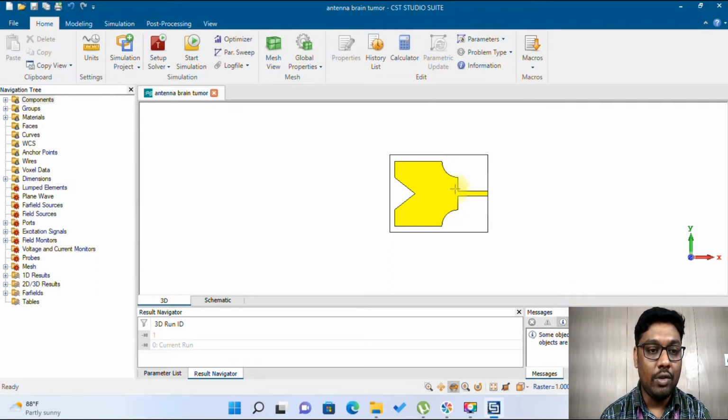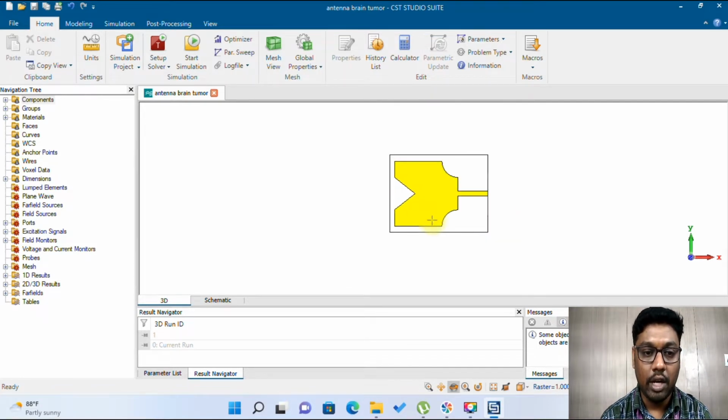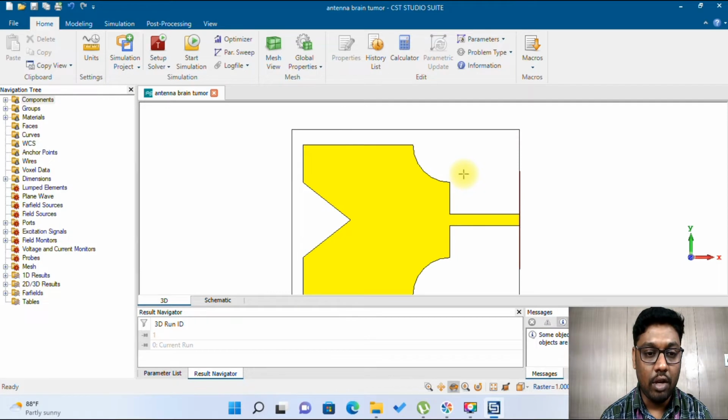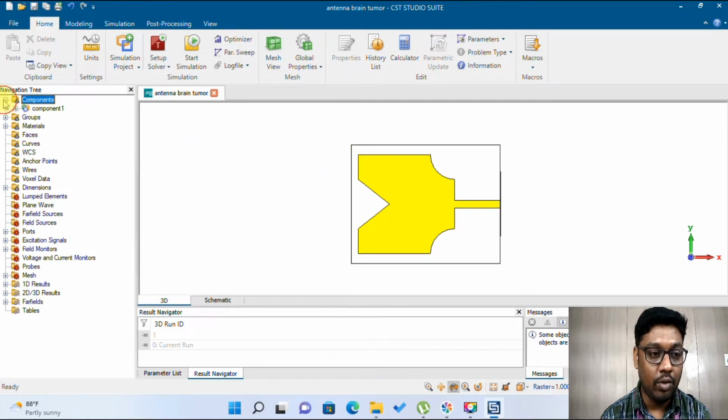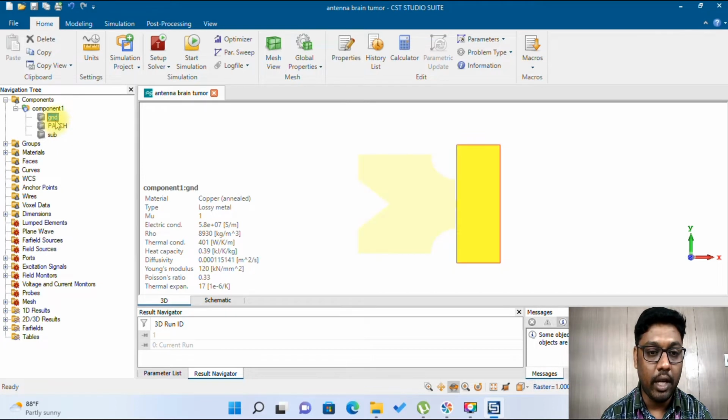What you see on the screen is the microstrip antenna that I designed. This is the front view, which starts with a basic rectangular microstrip, and I have made some modifications. Before that, I will show you the dimensions of this antenna so that you are able to replicate it.